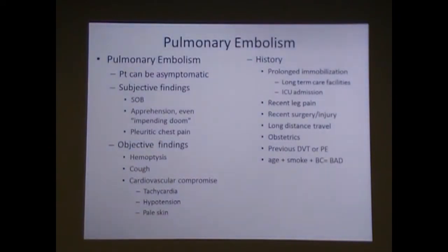Is everyone familiar with IVC filters? Okay. They're very simple to put in, and they save lives. It takes us, once we get them on a table, probably 8 minutes to put one in. It's super simple. Now getting them out is not simple. Think of a one-dimensional picture and trying to fish three-dimensionally. Because it's just 3 prongs, and then you have a little circle on top, and we're trying to hook that circle. It can be mind-numbing.